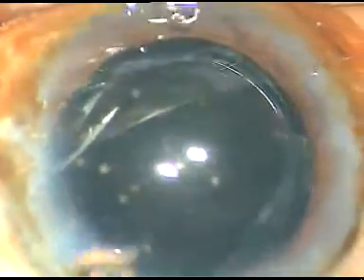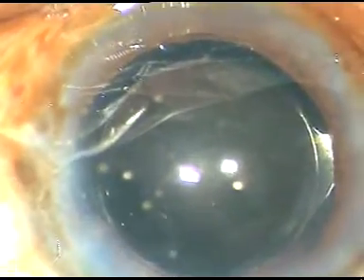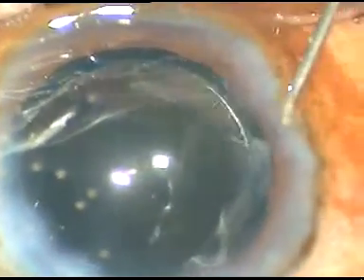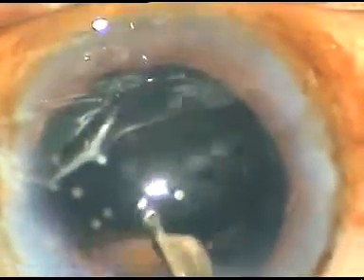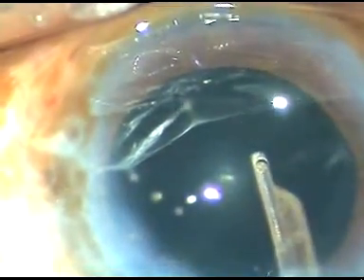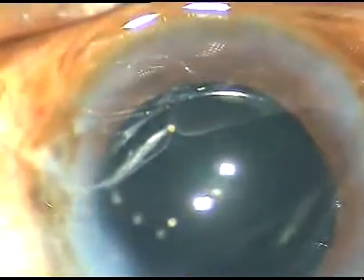I'm using the Simcoe cannula, just flushing — irrigation as well as aspiration — flushing the viscoelastic substance out of the entire chamber. I go behind the intraocular lens and flush the capsular bag; a lot of viscoelastic substance comes out — almost 80%. Then I use the irrigating probe of bi-manual IA, with both irrigation and aspiration together. I have been able to place the intraocular lens and remove all the viscoelastic substance. Moxifloxacin has been injected into the anterior chamber, and now I am hydrating the side ports so that they become waterproof. Here is the final wash with BSS — the case is over. This is a one-eyed patient; I did not use a multi-piece intraocular lens to avoid haptic-related complications. Thank you very much for your attention.